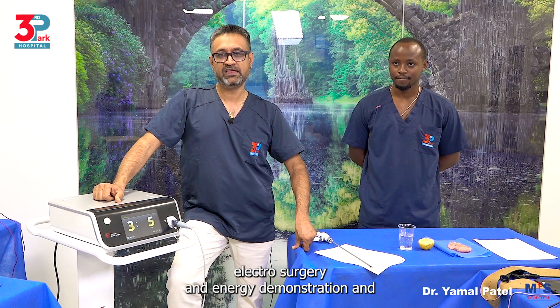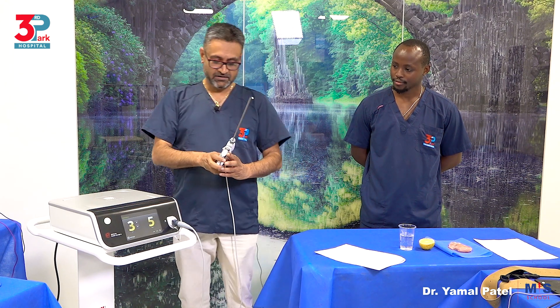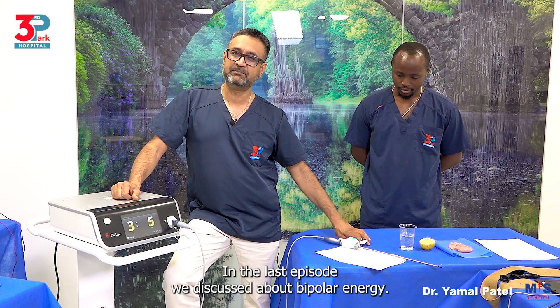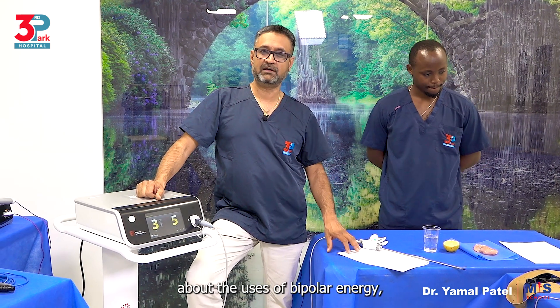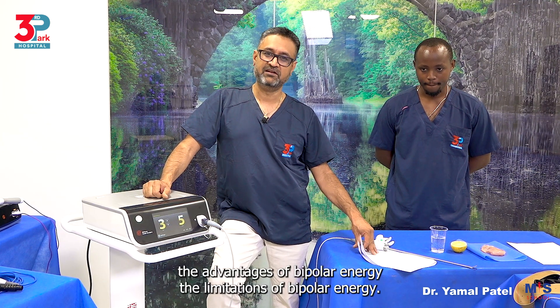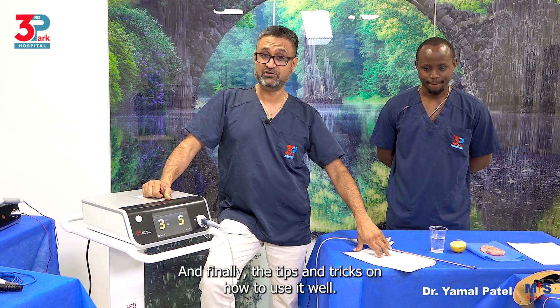Welcome back to electrosurgery and energy demonstration and discussion. Today we are going to be discussing ultrasonic energy. In the last episode we discussed bipolar energy — the different aspects about its uses, the advantages of bipolar energy, the limitations of bipolar energy, and finally the tips and tricks on how to use it well.